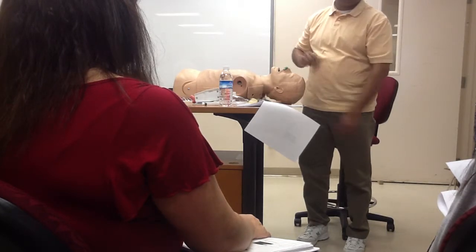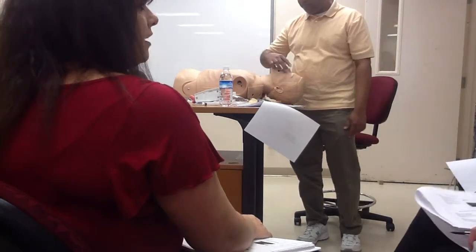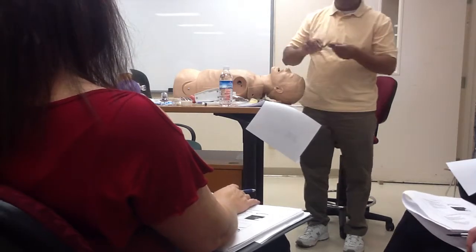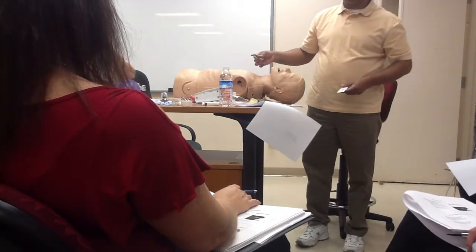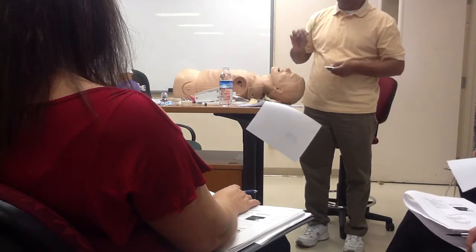Probably good advice. Keep it simple. See, we could check off on that. But you're supposed to lubricate it too. Yeah. The only difference is we have to lubricate this one before you put it in. An oral airway, you don't lubricate. This one, you make sure you lubricate.